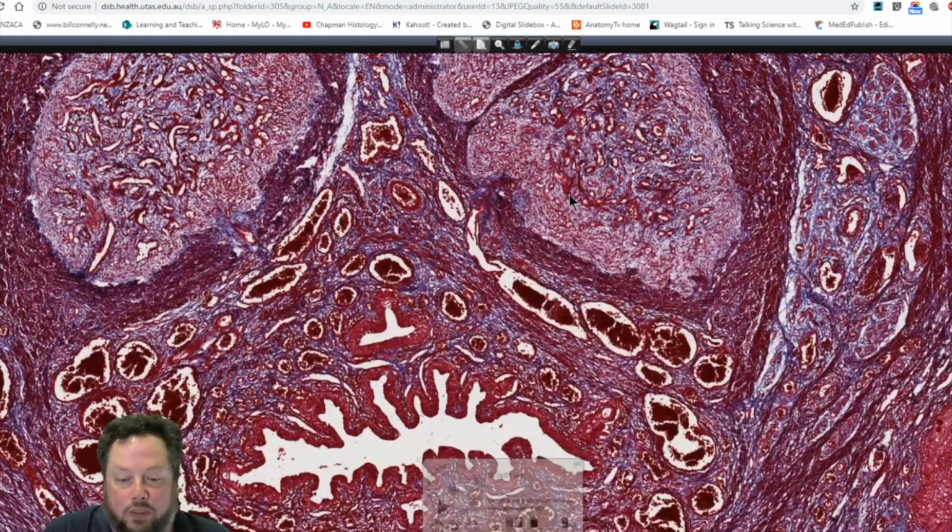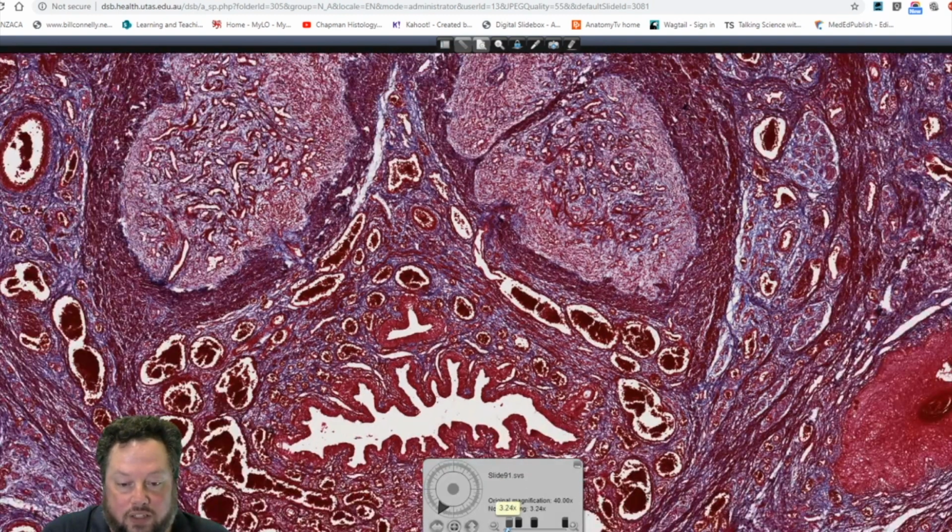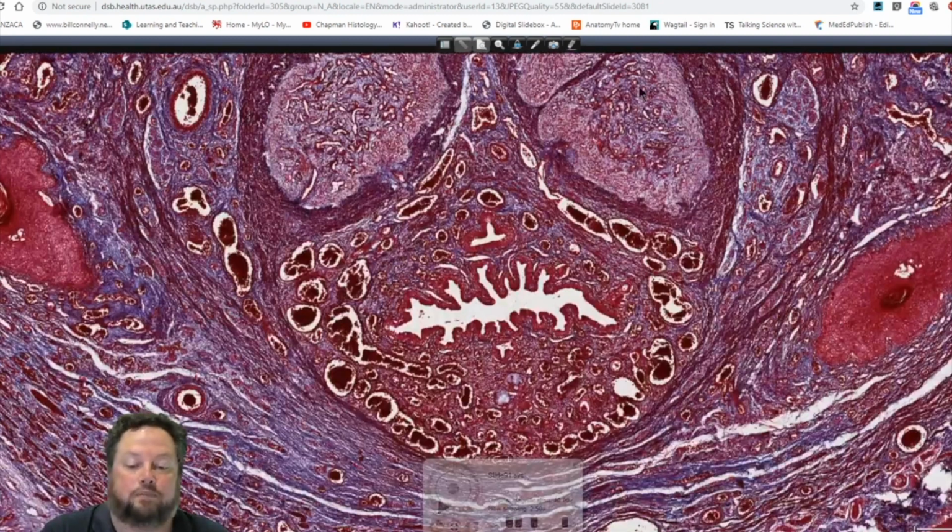Yeah, it does look a little bit like he's looking into your soul. It looks a little bit like someone screaming or something. It's quite terrifying, this section.